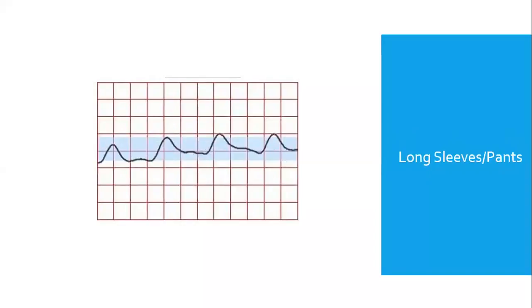Wearing clothes that cover the arms or legs beneath the cuffs can dampen the results of the PADnet study. On this slide is an example of the study performed of the patient with pants on. Since the cuffs are meant to be placed directly on the skin, except when the patient has an open ulcer, wearing clothing beneath the cuffs can diminish the waveforms and suggest a false positive.